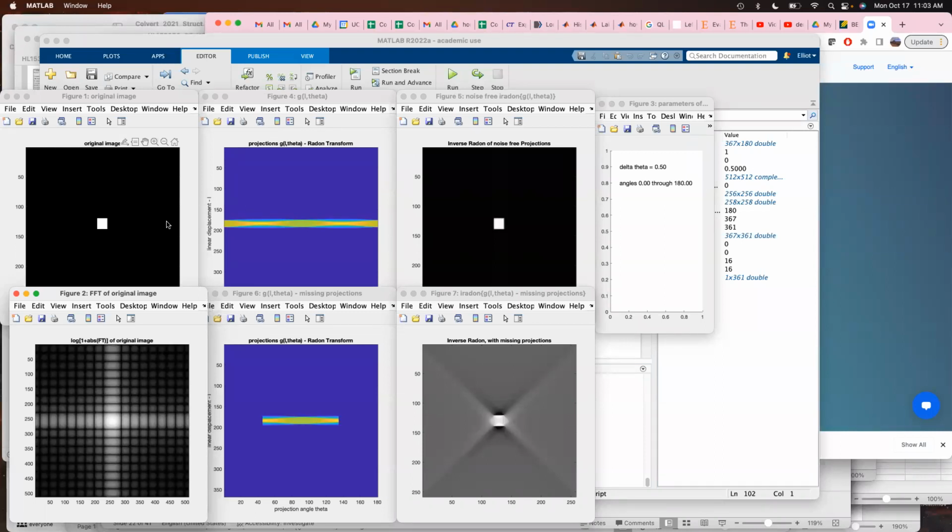If I look at, say, a row of this image and ask what the Fourier transform of that function is, when I look at the Fourier transform across that, it is a sinc function. So it's this sinc thing, which you can see has a peak, and then these side lobes go out like that. If we plotted the real component, these would go negative and positive, negative and positive. The position of these zeros is inversely proportional to the width of that rectangle. So if it was really wide, the zeros would come in closer. If it's a really narrow rectangle, those zeros move out.